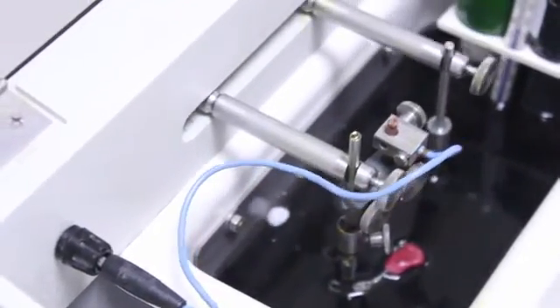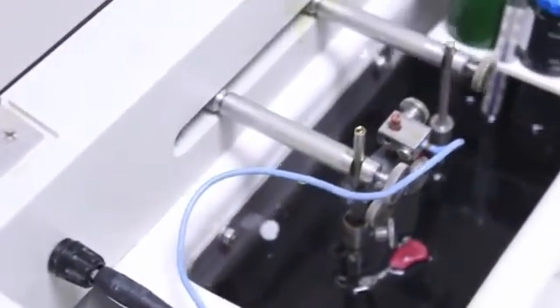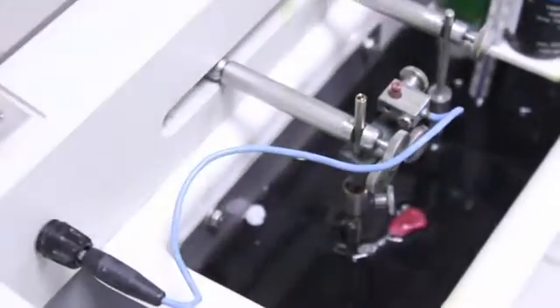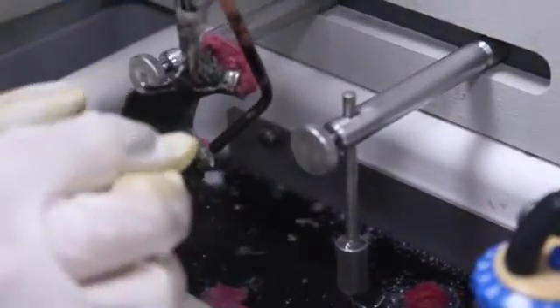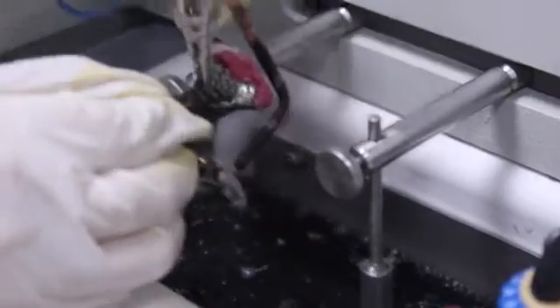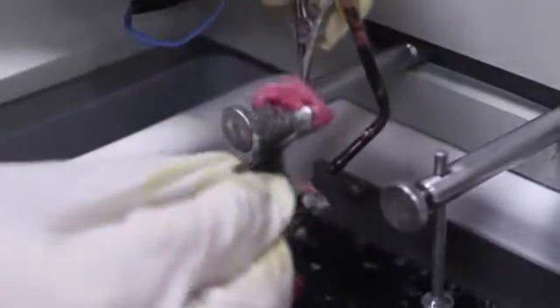Note that the retentive clasp arms are protected using base plate wax to avoid overpolishing. Once the procedure is completed, the cast is removed from the electropolishing machine and cleaned under running tap water.